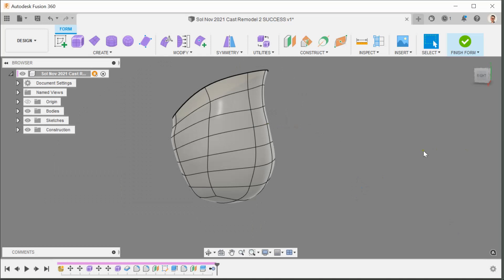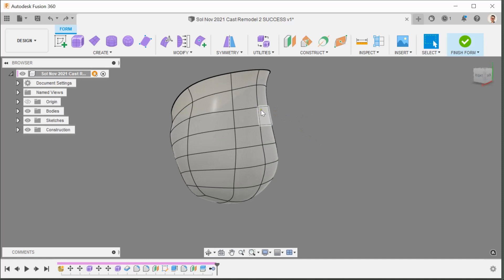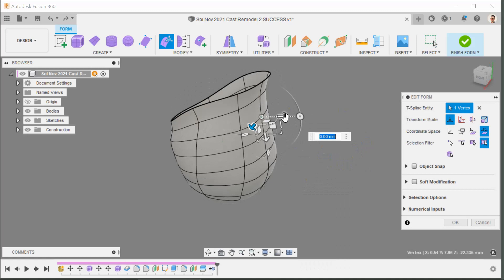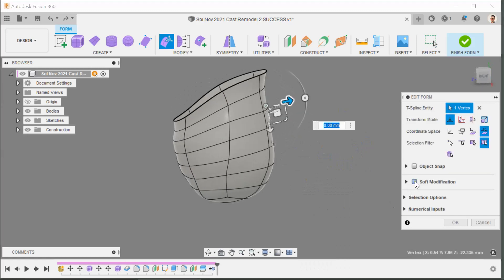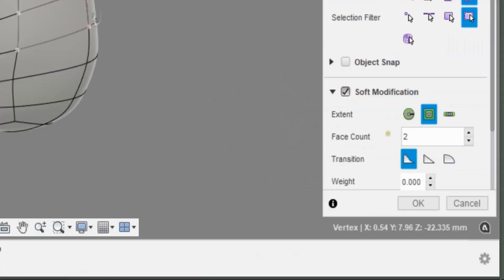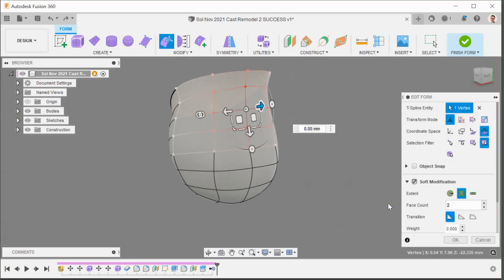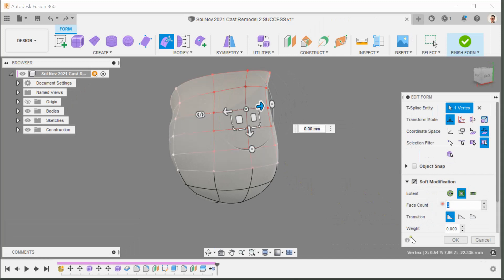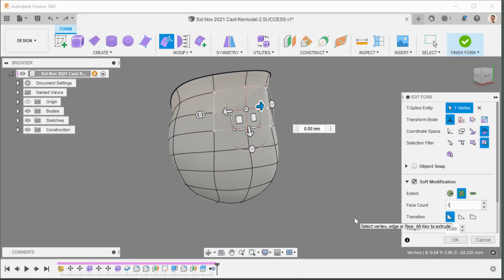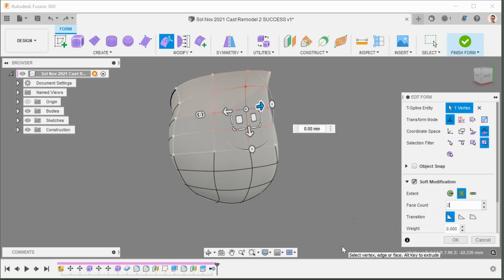Working like that can end up getting quite lumpy features, so I'm going to show you another way. Control Z to undo. This time I'll right-click, Edit Form again, select the direction I want to travel, and click Soft Modification. I've entered 2 faces — it was defaulted to 3 — so the modification spreads more evenly. At 2 faces it's slightly more focused, and at 1 it's almost like not using soft modification at all.